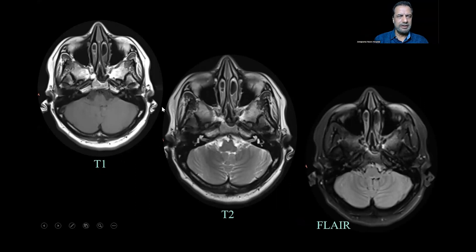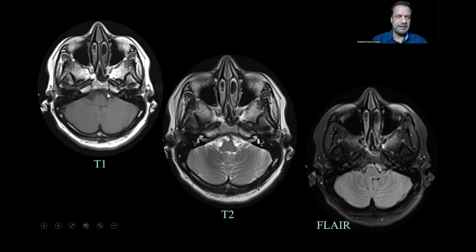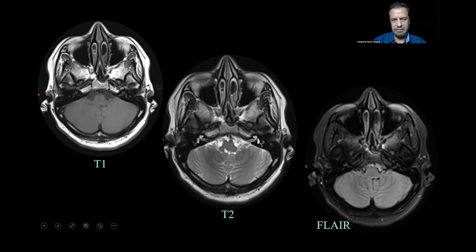As you go a little bit upward, the maxillary sinus is getting smaller and you will see the skull base bone, which is not very clearly seen on MRI — CT would be a better option for looking at skull base bones. The medulla is seen, and you can see that the lateral medullary and pyramid area can be quite well demarcated. The fourth ventricle, the vermis, and the cerebellum can be seen, along with the cranial nerve going into the jugular foramen on both sides.